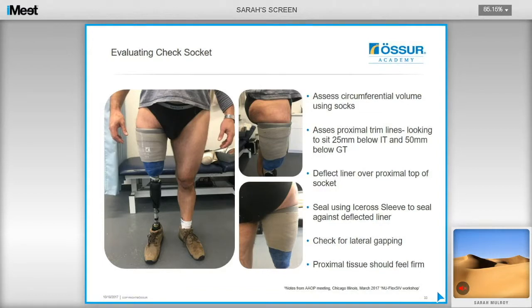When assessing the check socket, assess the circumferential volume using socks and assess the proximal trim lines, looking for the trim line to sit 25mm below the IT and 50mm below the GT. Due to the way the cast is taken, the medial wall might sit around 5mm higher than the lateral trim line — keep this medial wall high for soft tissue support and to avoid adductor roll. Deflect the liner over the proximal top of the socket, use the Icross knee sleeve to seal against it, obtain vacuum from the Unity pump by having the user take some steps, and check for lateral gapping. The proximal tissue should feel firm, indicating adequate soft tissue compression. If accurate measurements are taken and the cast is reduced according to the algorithm, potentially there will be nothing to adjust at check socket stage, as the recipe works very well.